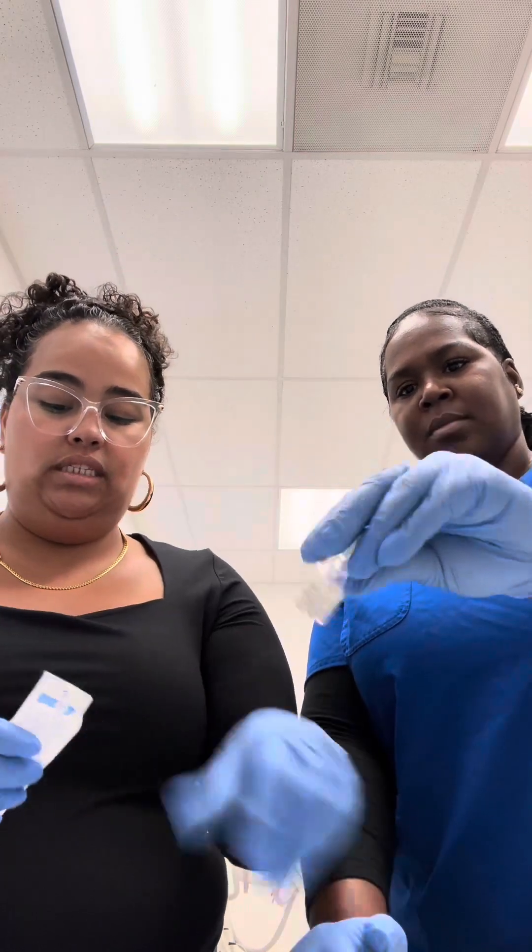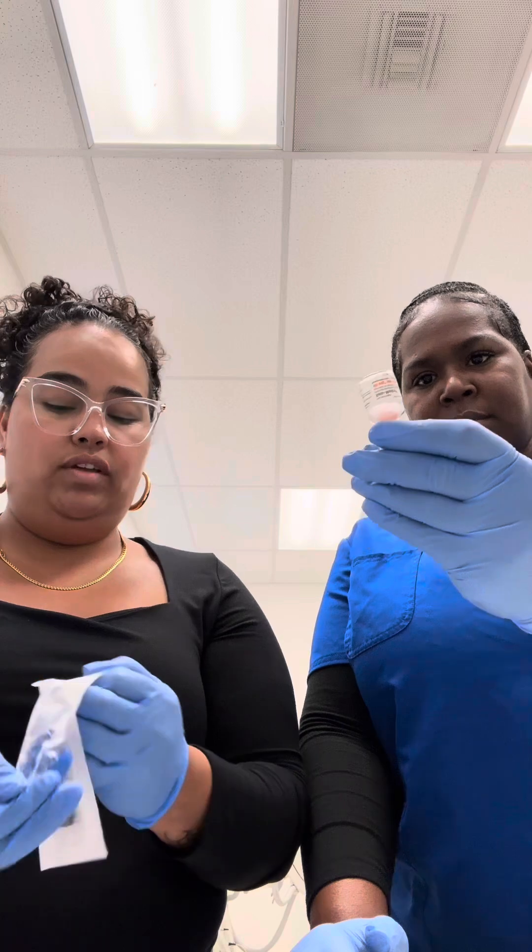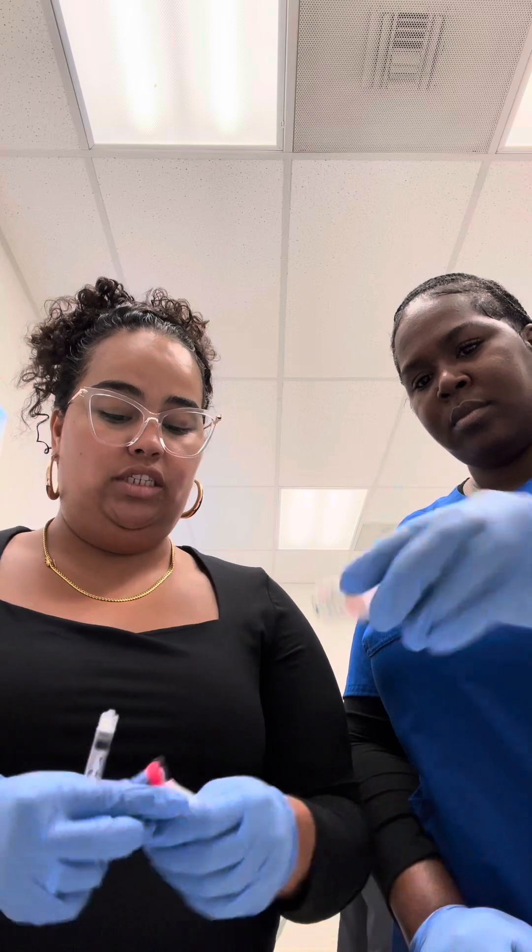Then you have your syringe — these are 1cc. We're putting two of them together, so that's 2cc. You can use a 3cc syringe; cc and mL are equivalent. Then we have our blunt needle that we're going to use to draw up the medication. Put your needle on and cap it.